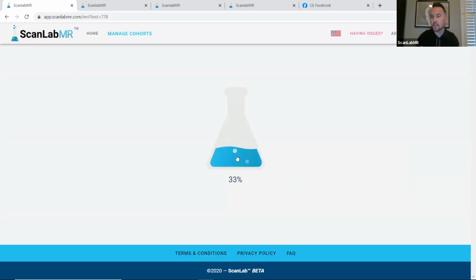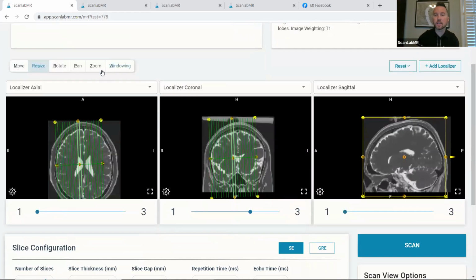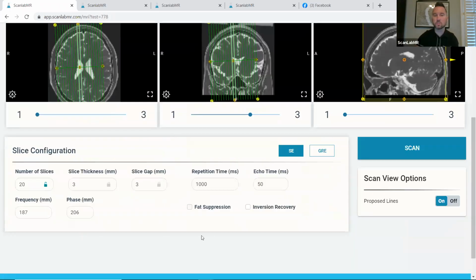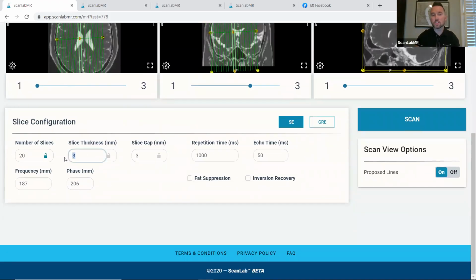We won't do an entire contrast lab examination because of time, but we still have the exact same overall interface, with some new things. Instead of just saying prescribe me an axial or a sagittal, now I'm saying give me a sagittal T1. Within this, we would have to know our slice thicknesses. Let's say I do a 5 skip 1.